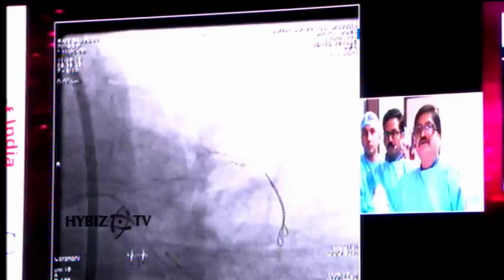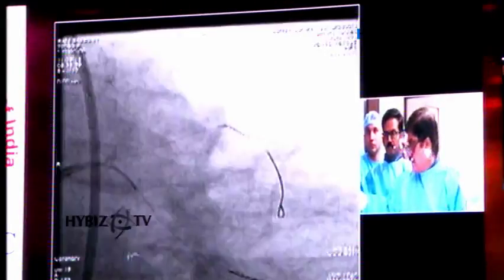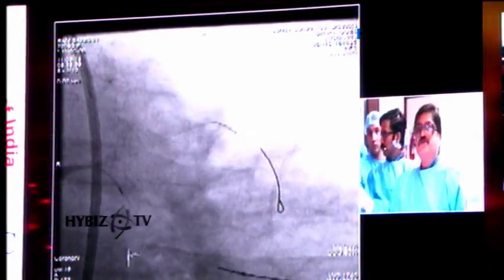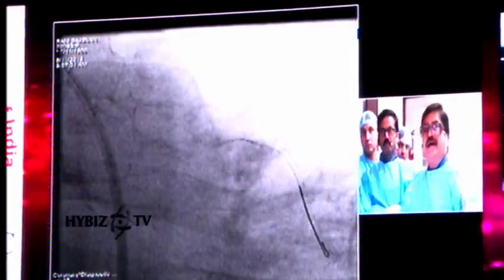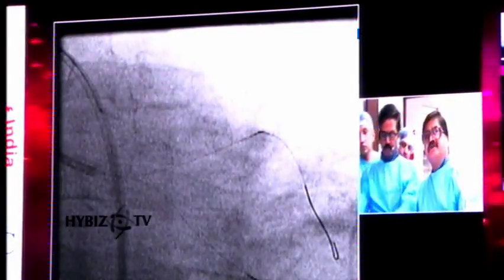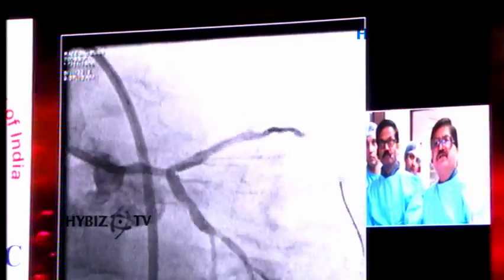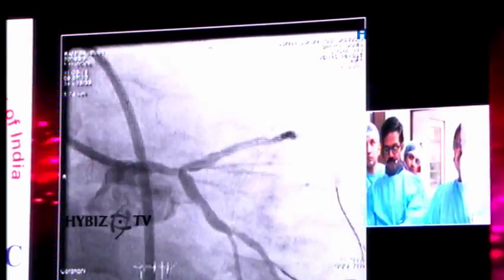Forward, please. Come to the last angio, where we are now. So those are the IVUS withdrawals. Come to the last angio, please. Okay, so that is where I am right now. I have done the IVUS, and I have done some ballooning of both the ostia with a 3.0. Incidentally, I used a cutting balloon, which I thought gives you less dissections. So that's where I am.